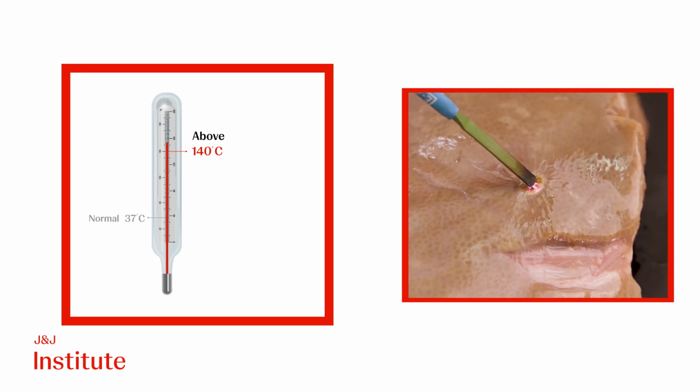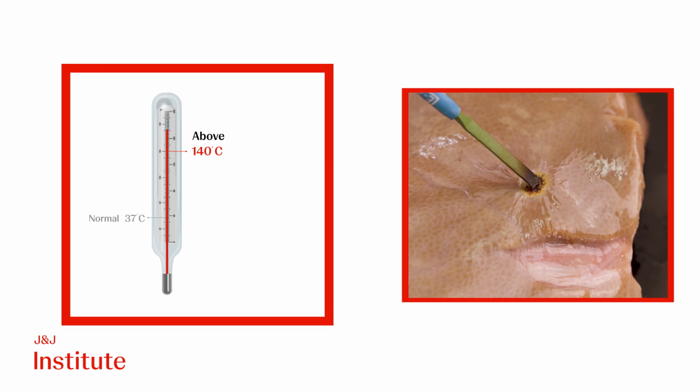Further escalation of temperatures prompts the oxidation of proteins and carbohydrates, resulting in a black eschar. Similar to leaving food on the stove for too long, the fluid escapes as steam and the remaining material burns, forming a sticky black layer. Think of the accumulation we observe on the tips of our energy devices during surgery.